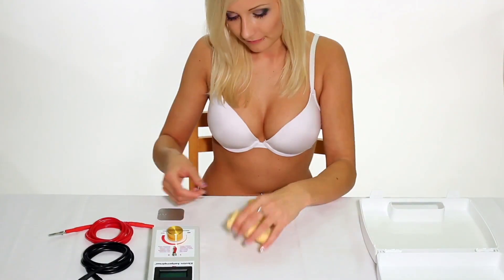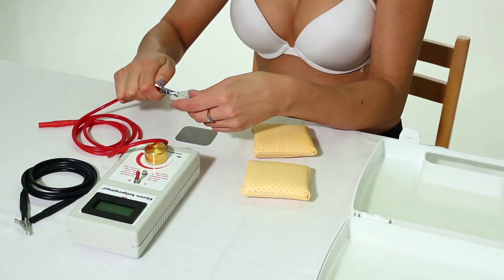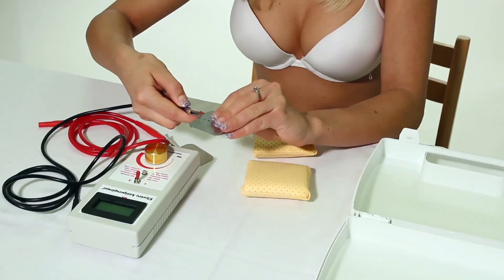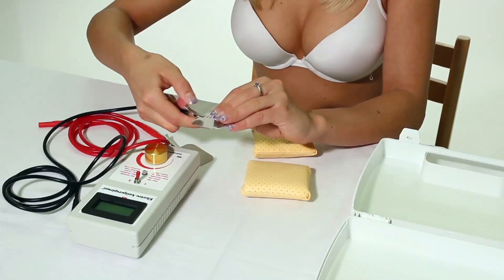Take one special electrode out of each comfortable adapter. Connect these electrodes to the supplied conductors so that the hooks at their end get caught in one of the holes of each electrode.